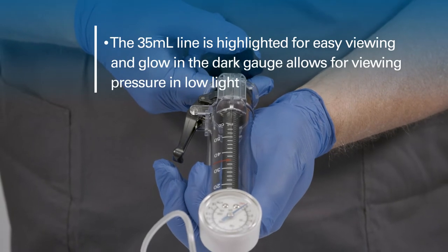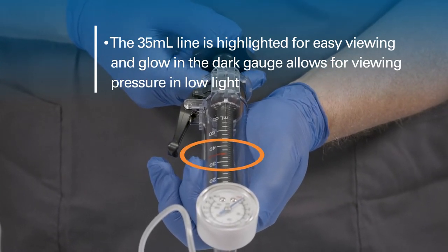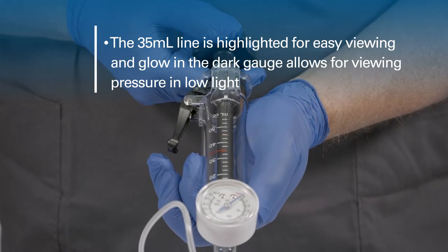The 35ml fill line is highlighted for easy viewing, and the glow-in-the-dark gauge allows for viewing of the pressure in low light.